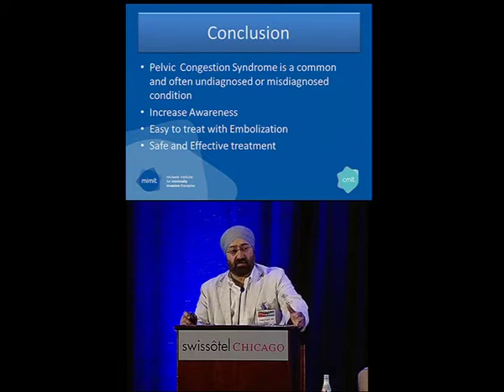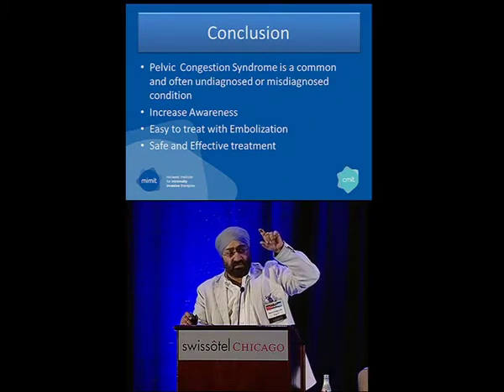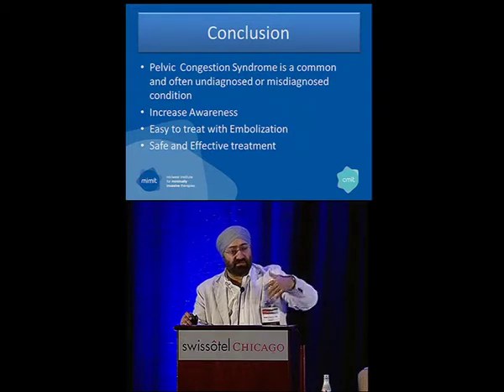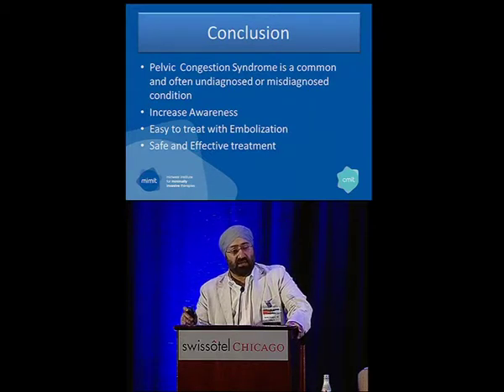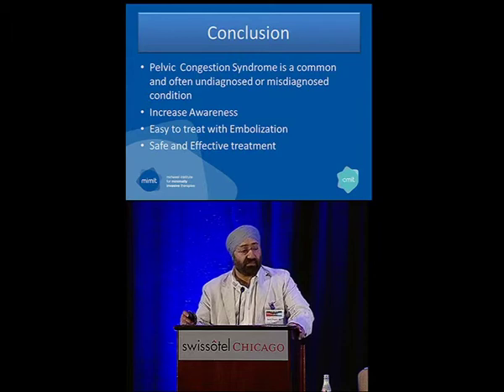As a technical point, it's important not to just drop the coil at the top, at the ovarian vein, but to actually come down, which is very similar to what we do with varicocele now. And again, it's the same battle with the urologist there. They see their laparoscopic procedure, and so many of them go, I'll just clip it, it's okay. But then they come back because they develop collaterals from elsewhere. So, two very good points.